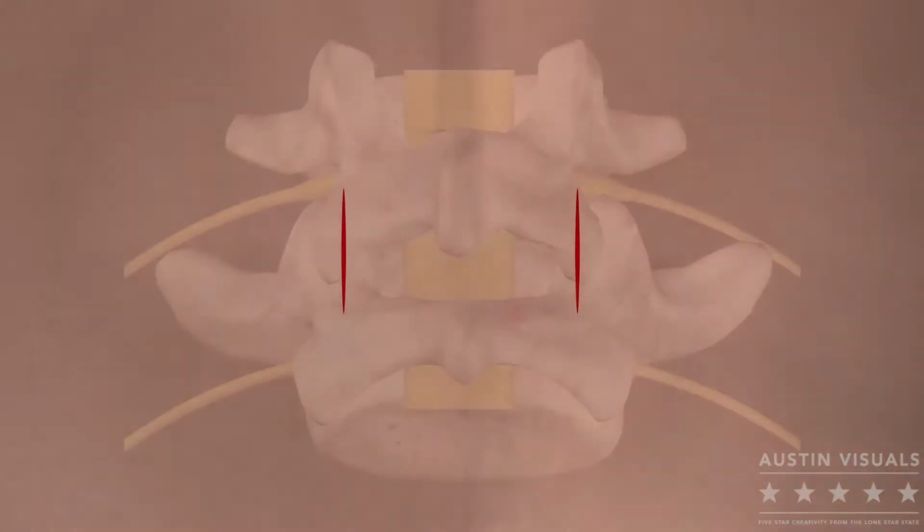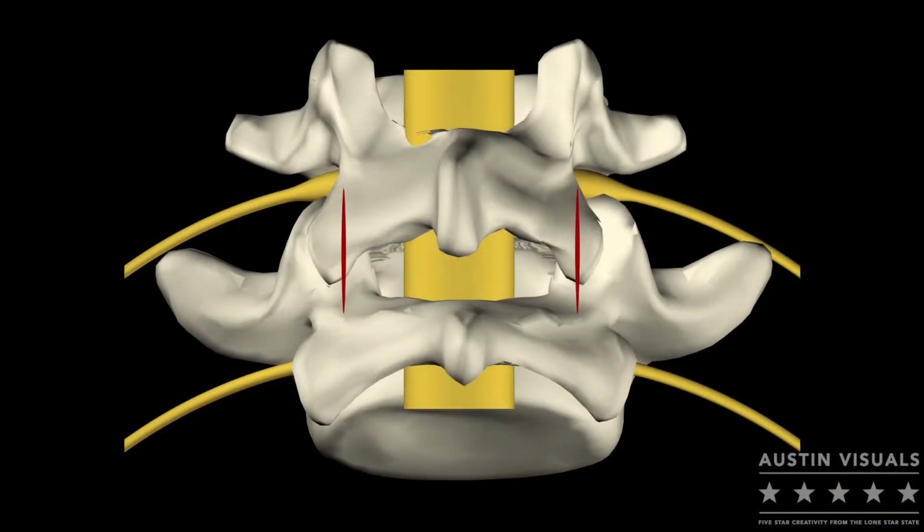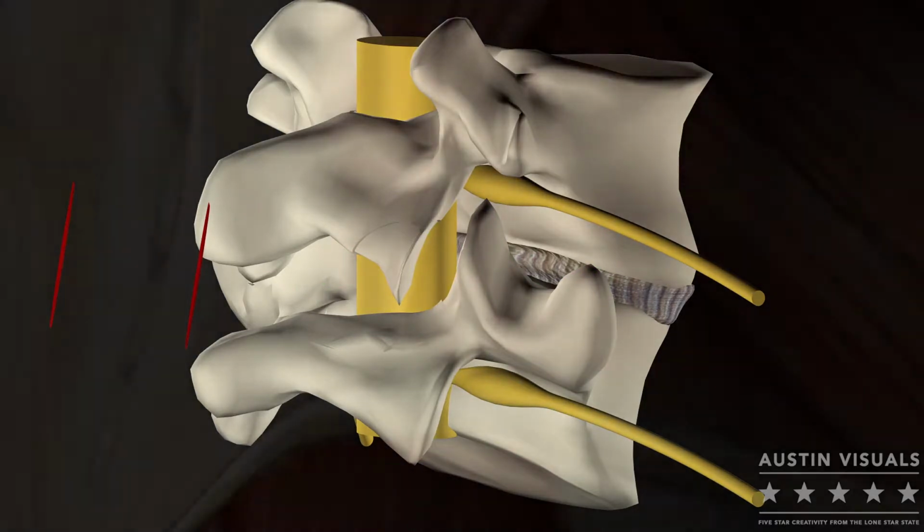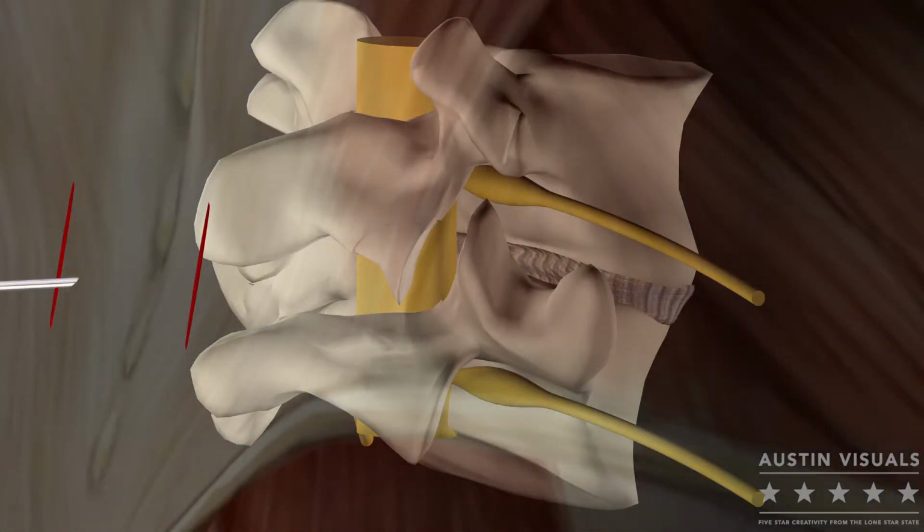This is how it works. Through two paraspinal incisions, right and left, the surgeon advances two Jamshidi needles or pins to the recognized percutaneous PePLIF work-safe area and lateral disc space. To do so, the needles are advanced under navigation to the facet joint above the inferior pedicle, then through the lower aspect of the foramen and ipsilateral disc space.